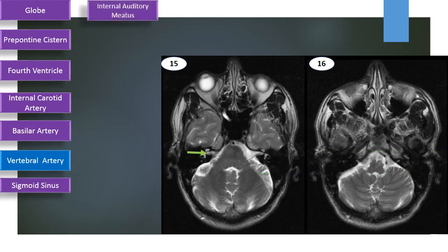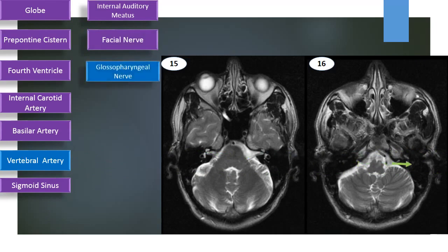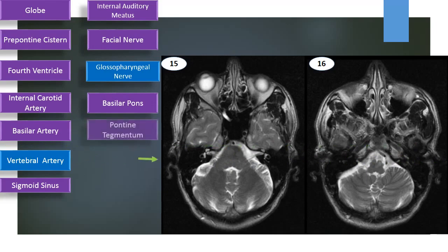Internal auditory meatus, which is a cone-shaped structure, and the facial nerve, which is entering the internal auditory meatus. Glossopharyngeal nerve, basilar pons, pontine tegmentum.